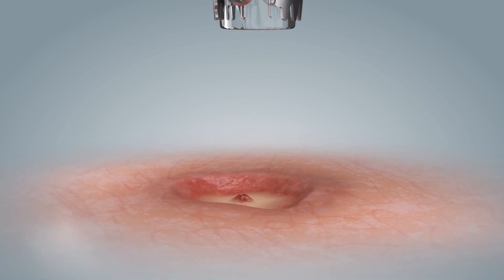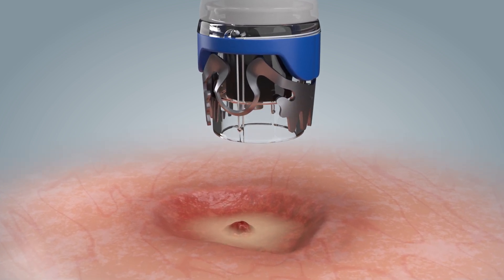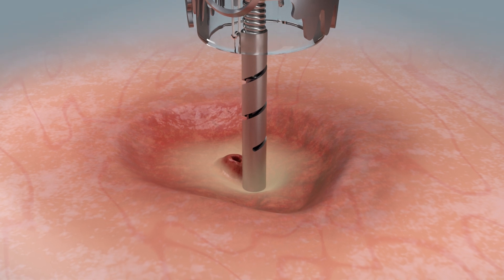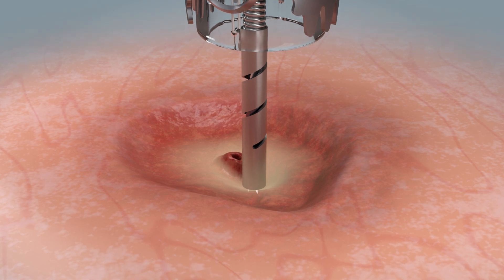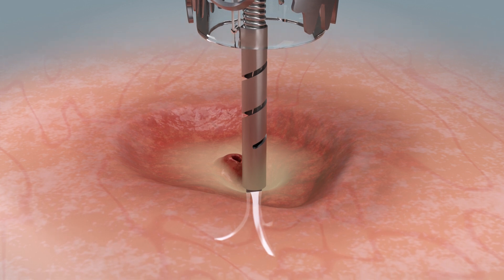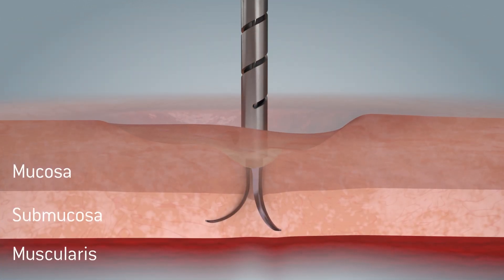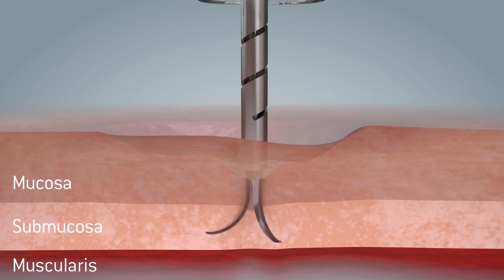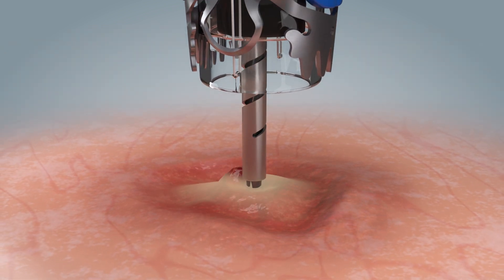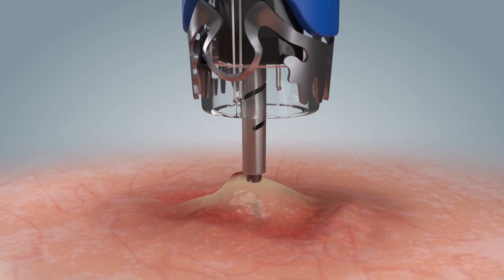To do this, the application site for the clip is first targeted with the application cap. The instrument tip is then positioned on the appropriate point. The anchor needles are pushed out distally and spread open into the tissue. The penetration depth of the anchor needles is designed to minimize the risk of perforation. To minimize tissue tension, the endoscope is advanced along the instrument.